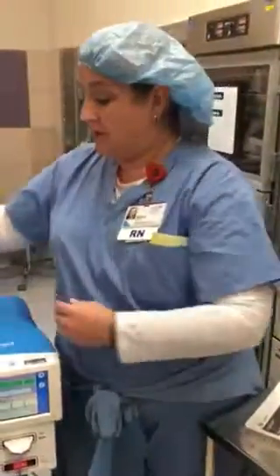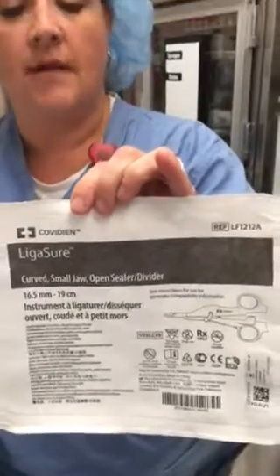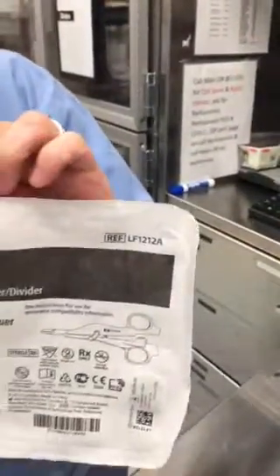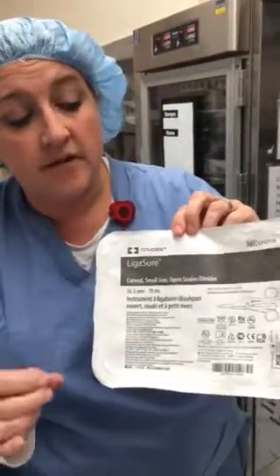Now, after opening the package, I would encourage you to save this item, which is the paper that was covering the packaging. If you notice, right here you have a reference number. If we are able to bill for these, this is the reference number you would place in your pick list in SurgeNet.